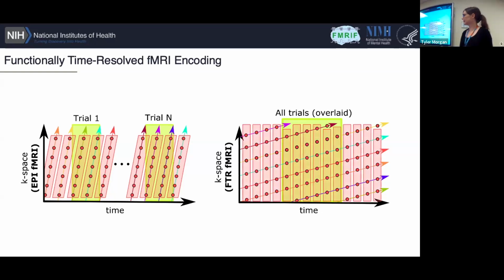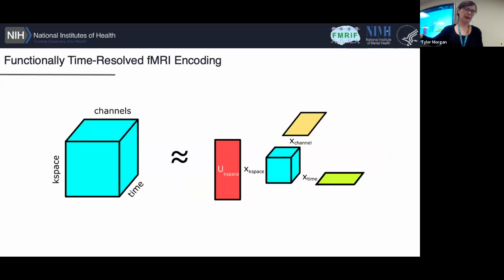So here, let's say, rather than these lines being a little bit slanted because it took time to get those images, we can just take all the things that are really close to this time point that we want to reconstruct, and we can try to reconstruct it. We have a time course of that particular trial response, etc. Again, we're going to use some mathematical tricks because we couldn't fill in that entire thing like I showed it in the little diagram, but there are missing data and you need to figure out how to fill it in.